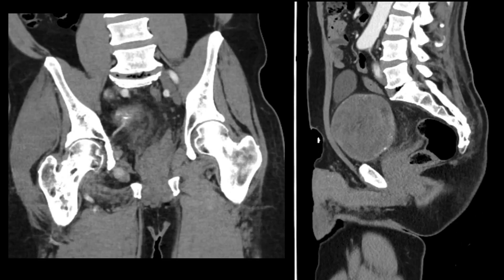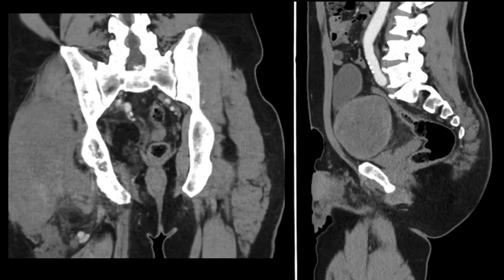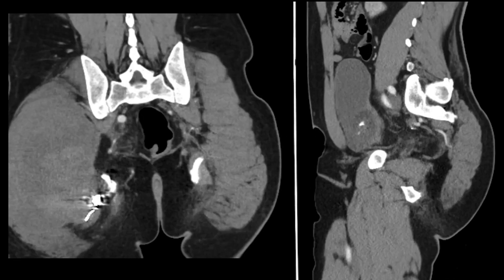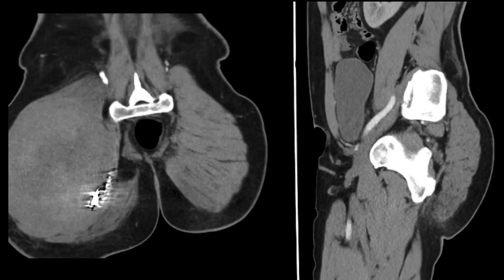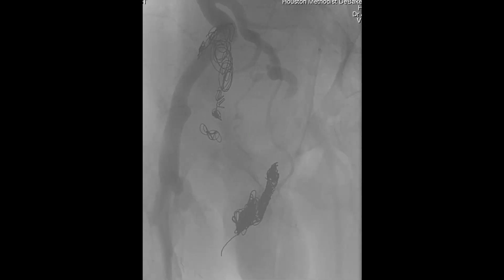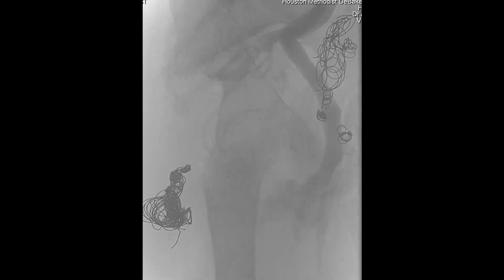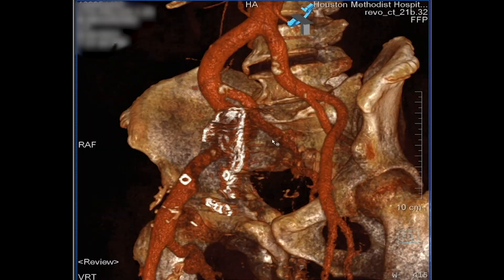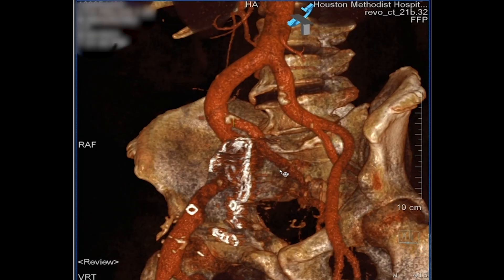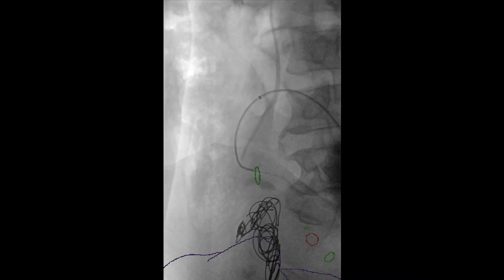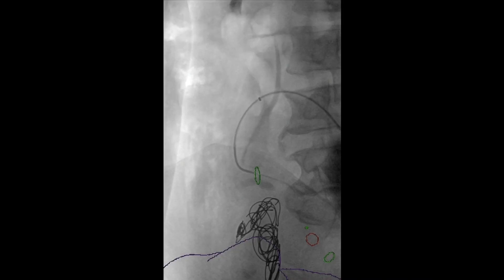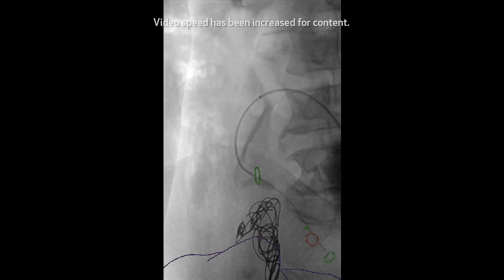This is the point where he could not lie prone, hence the reason the CT scan is actually upside down. We took him to the operating room and did an on-table cone beam CT and fused his images.